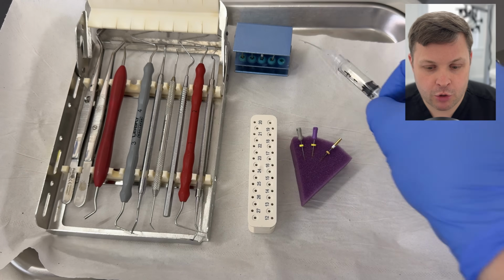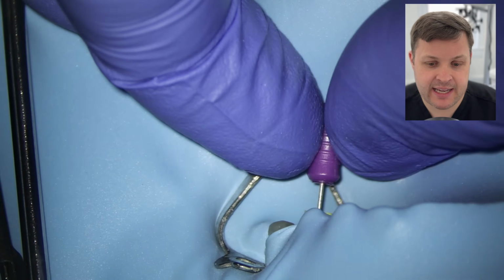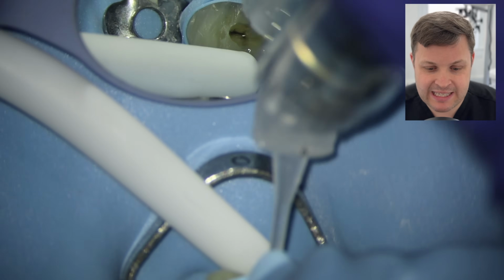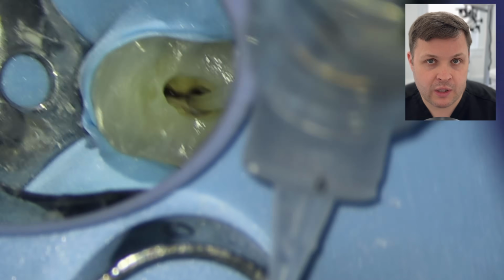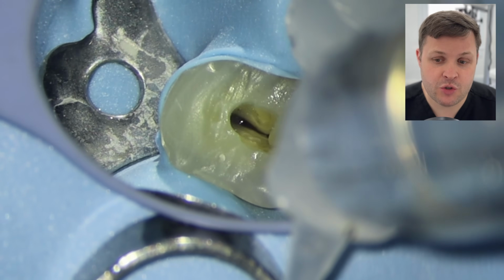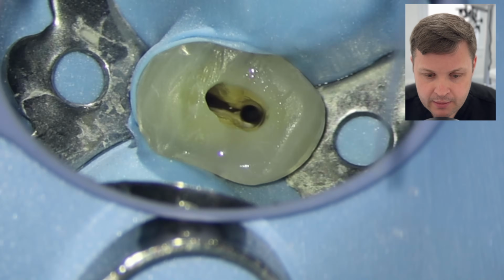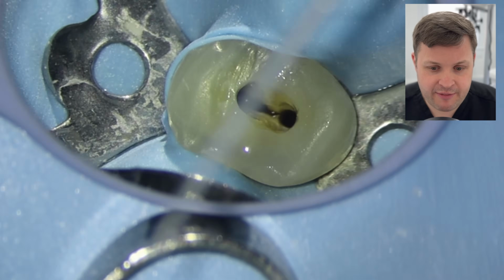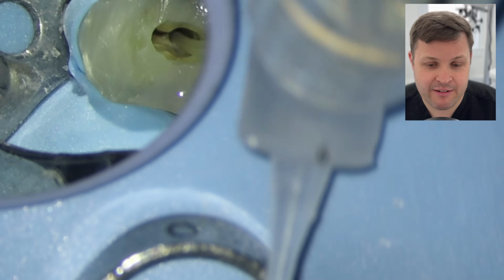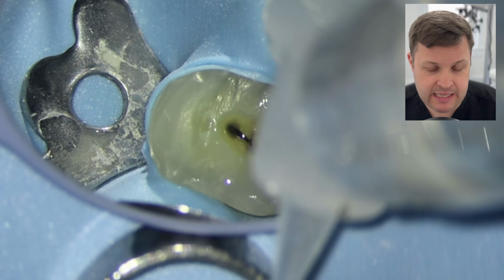I'm a little bit reluctant to use anything higher than a size 20 in this case, because I just think the roots are quite spindly, they're quite small, and I found it really, really difficult to get to the end. So using maybe a 25 would probably be pushing our luck slightly. And again, I'm just having a look at aspirating and irrigating the palatal and seeing if the buccal aspirates and irrigates at the same time.